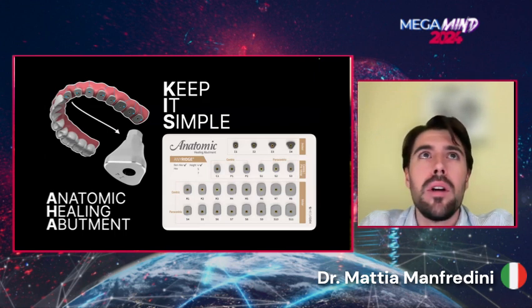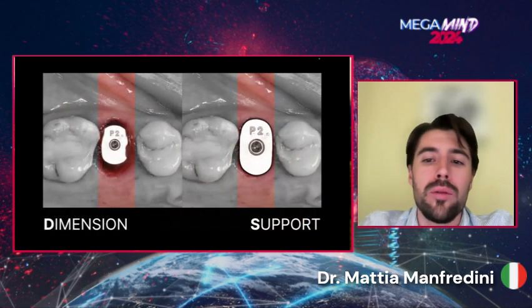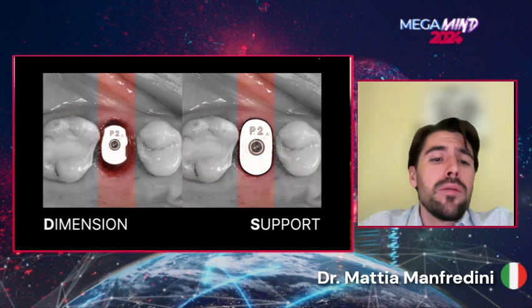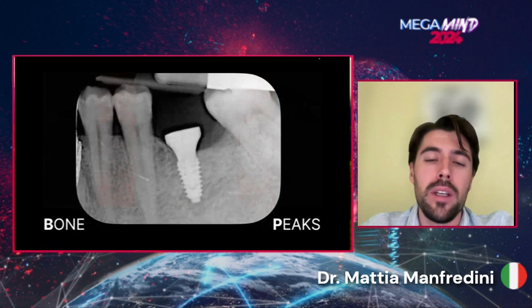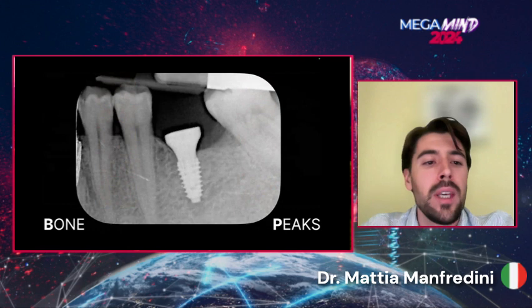It's almost 4 months that we are using this kind of abutment, both in post-extractive implant sites and in native bone as well. And these are the first cases. We must, of course, choose, if we're talking about post-extractive implantology, the right size to support the tissue, because the fundamental thing is to support the free gingival margin that we do in the customization. We need to do it also with the anatomical healing abutment. So we need a kit in order to choose the right dimension.